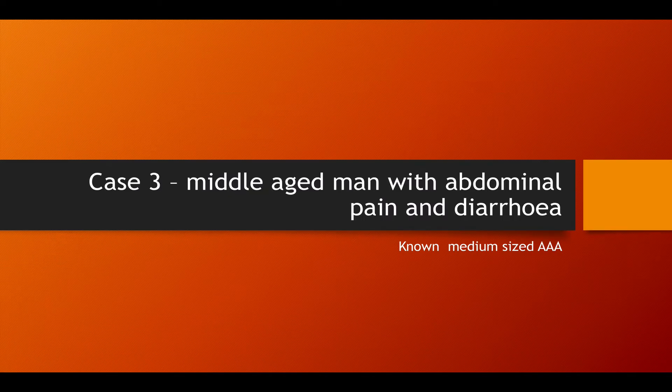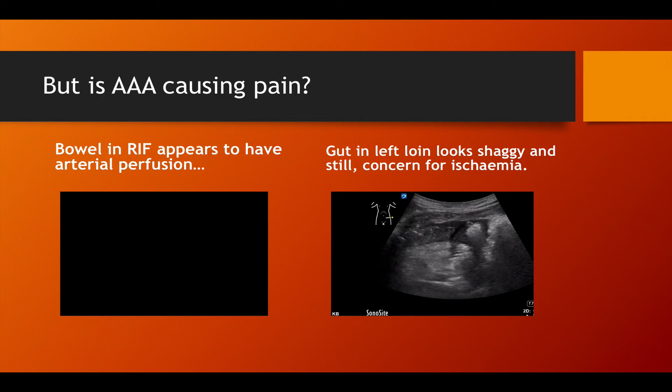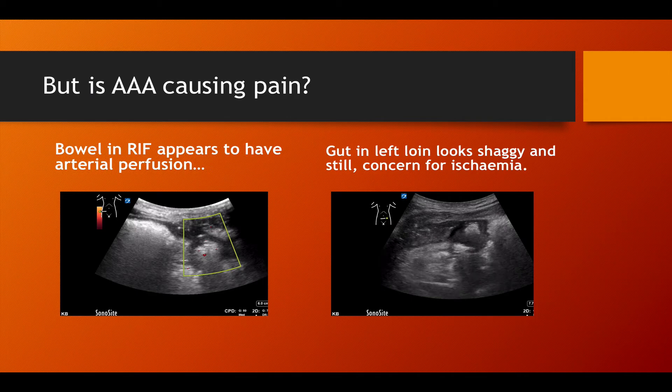Case 3 is a middle-aged patient with abdominal pain and diarrhea. There's a known medium-sized AAA, and when we put the probe on it's obvious. Note that the pictogram option on some ultrasound machines can be a really good way of giving a quick indication of probe position. But the question is: is the AAA actually what's causing the pain? In my experience I have missed a gut obstruction and a hernia simply because I was distracted by a really nice AAA.